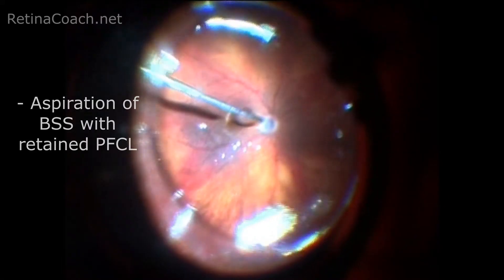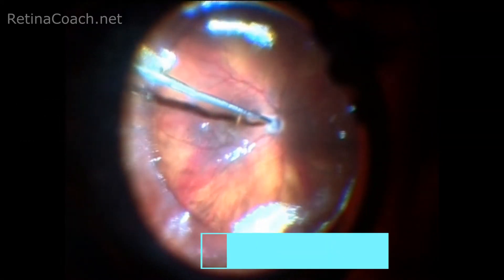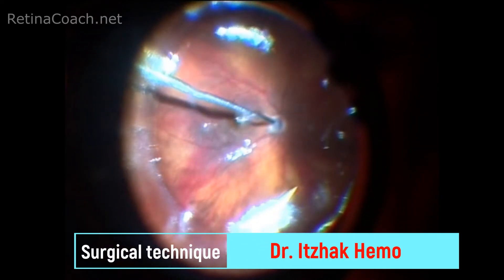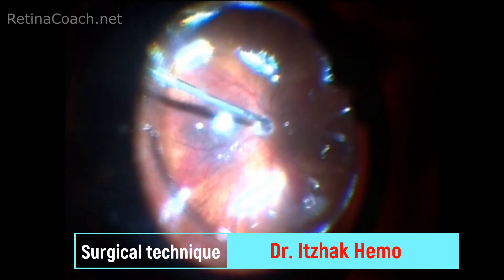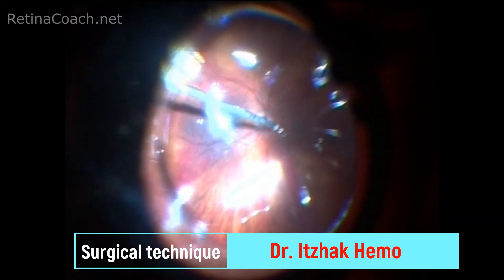After injection, the BSS solution is aspirated together with retained small PFC bubbles. This procedure can be repeated a few times and allows you to assure that no PFC was left in the eye.